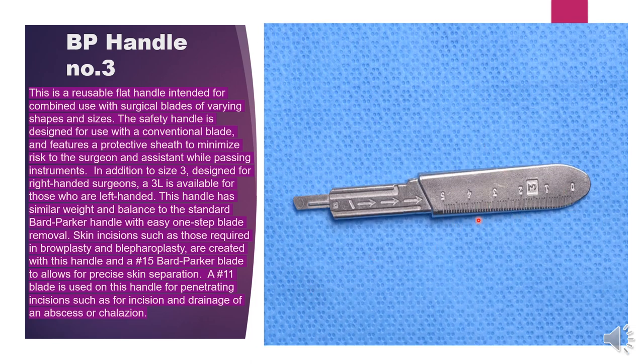There are different numbers, different sizes, and different shapes. BP handle number three is designed for right-handed surgeons; a 3L is available for left-handed surgeons. This handle has similar weight and balance to the standard Bard-Parker handle with easy one-step blade removal. Skin incisions such as those required in browplasty and blepharoplasty are created with a number 15 blade. Number 11 blade is used on this handle for penetrating incisions such as incision and drainage of abscesses.